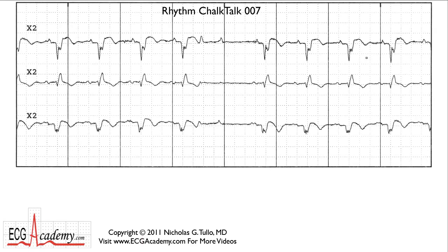This is a Holter monitor that I picked up, and it's three simultaneous leads. We're going to get started with looking at the forest. What stands out very clearly in this strip is that there's a pause here. There seems to be a regular rhythm going along. If we try to measure the rate starting with this heavy line: 300, 150, 100, 75 — it's just about 75 beats per minute. So we have a regular rhythm of 75 beats per minute. The QRS complex is rather wide, so there looks like a bundle branch block is going on. The duration is at least 160 milliseconds.